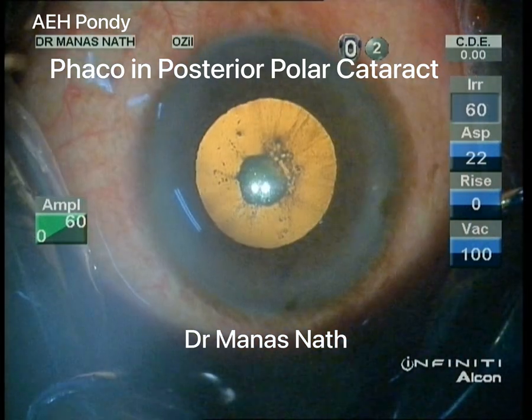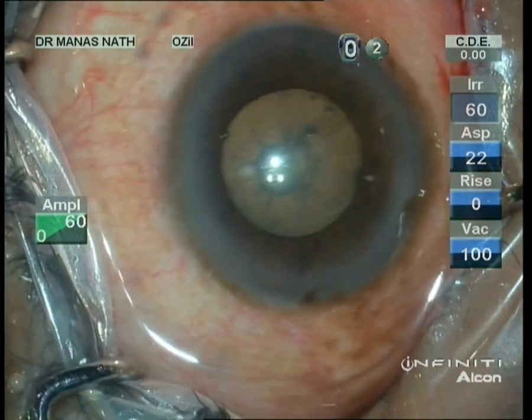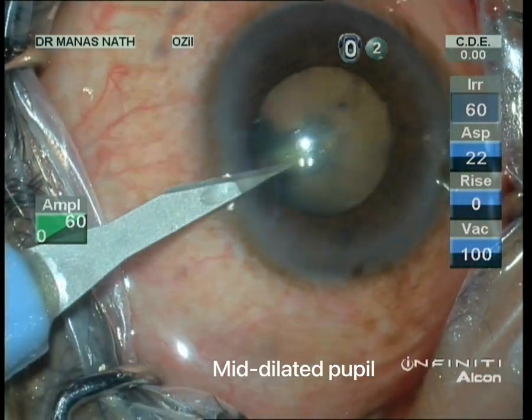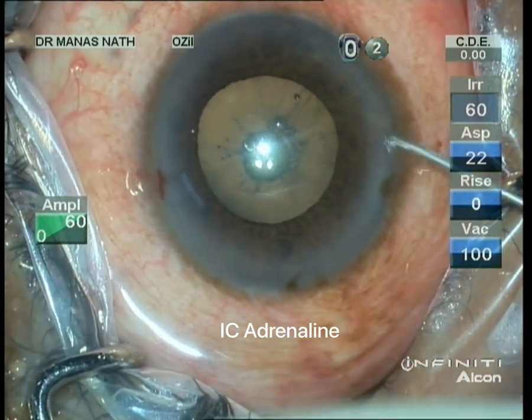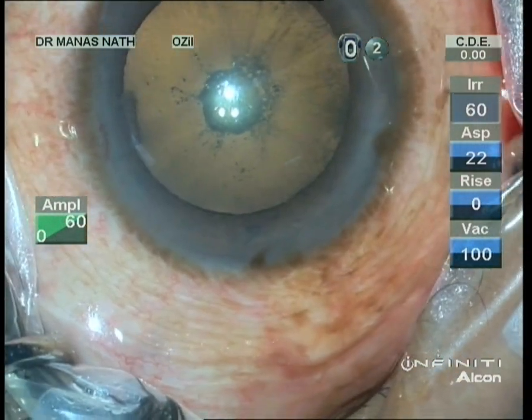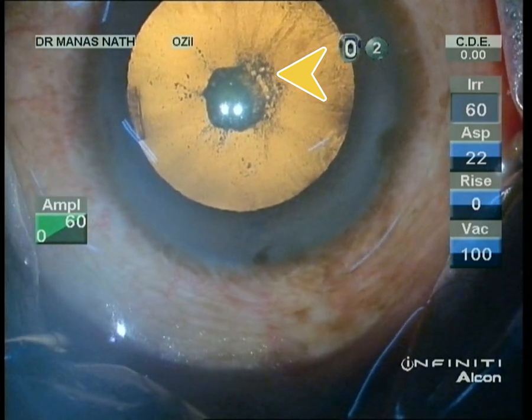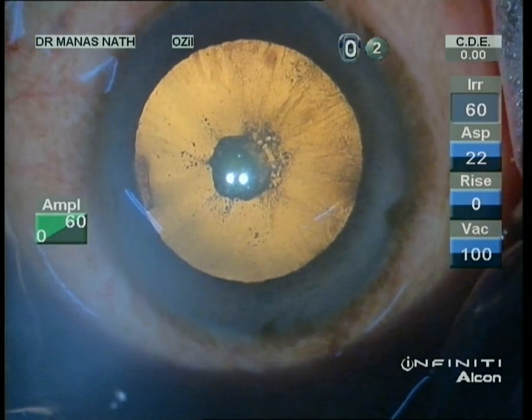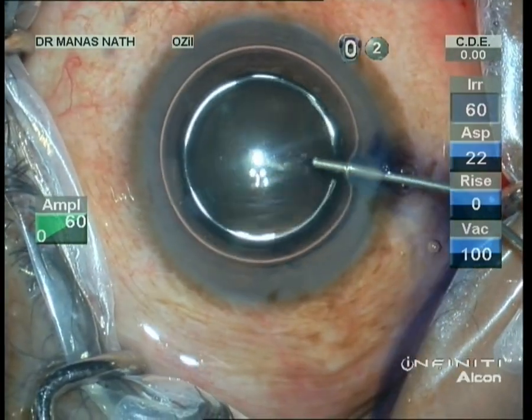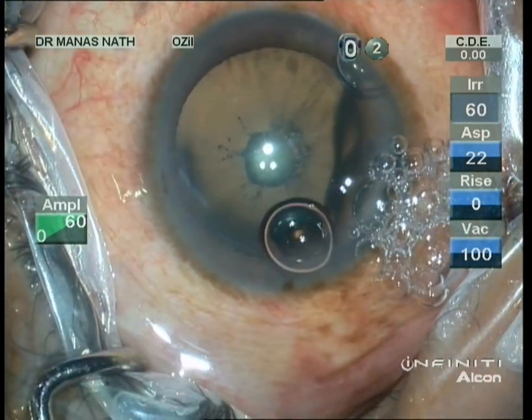Hello everyone. This is a case of a posterior polar cataract. Under the slit lamp, the size was around three millimeters — quite a dense PPC. You can also see the riders, suggesting it to be a progressive posterior polar cataract. I was a little bit worried about the dots at the margin; it can be the Daljit Singh sign, indicating a grade three posterior polar cataract according to Daljit Singh classification.